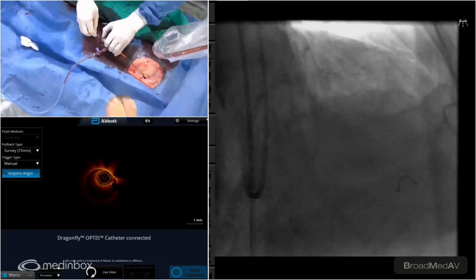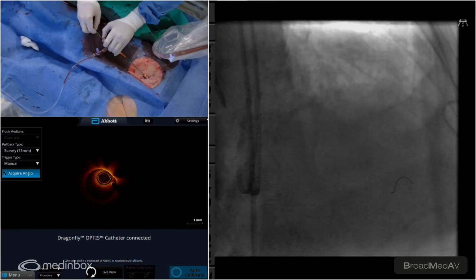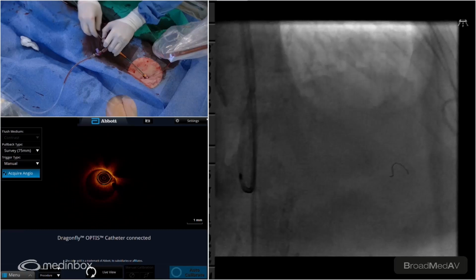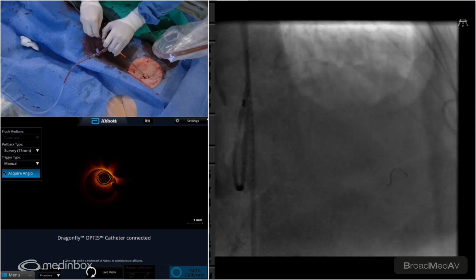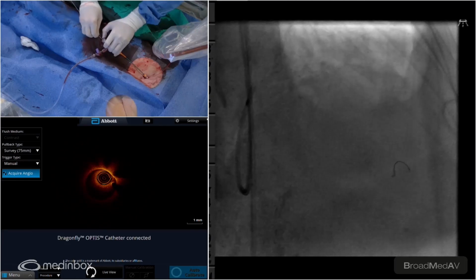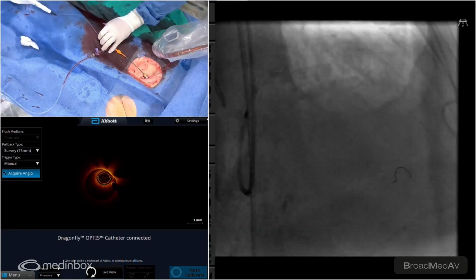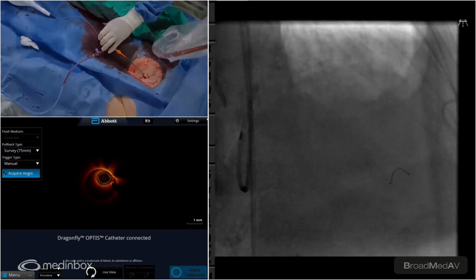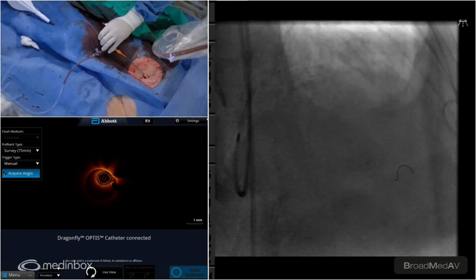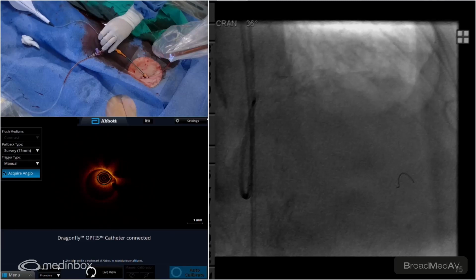Come with me, keep coming. Pause for a sec. Perfect. Leave it there. Make sure to take the tension back, nothing sitting in there. My wire's stable. I usually do a little. You can see that tension is still there a little bit. I want to see if I can get it in a bit more. Perfect. There you go. So you guys can have a look on there for me, see if there's any decels.